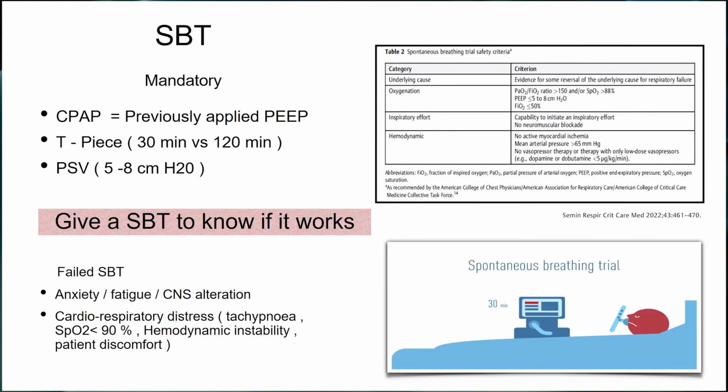A spontaneous breathing trial is mandatory. Before you subject a patient to extubation, we need to look at whether the patient is able to breathe with the least support. How do we give it? Either through CPAP, pressure support, or T-piece. Again, it's a debate. The guidelines recommend that probably having some sort of inspiratory support is better than not having, whereas some believe that the T-piece replicates the real-life conditions when the patient is off the ventilator. The only point we need to remember is you will not know whether a patient is going to tolerate a spontaneous breathing trial until and unless you give an SBT.